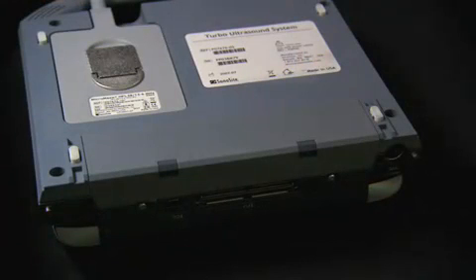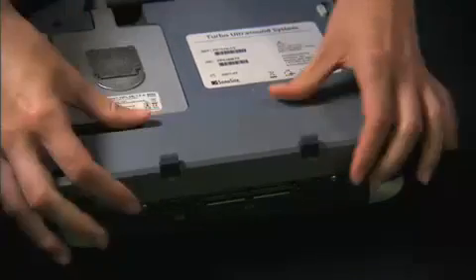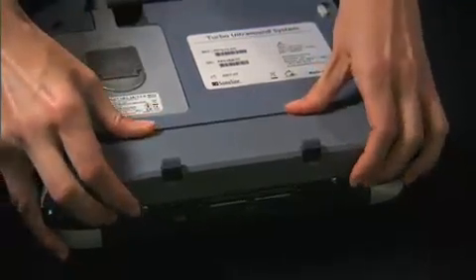If the battery is being installed for the first time, it will need to be charged. To remove the battery, push up on the two locking levers, slide the battery back, and lift the battery from the compartment.